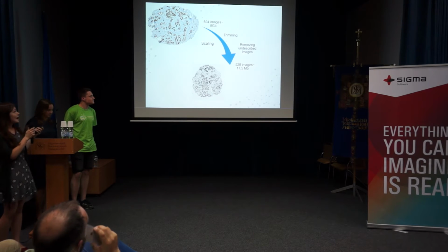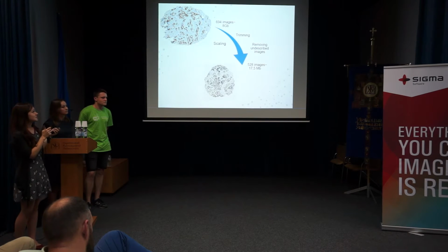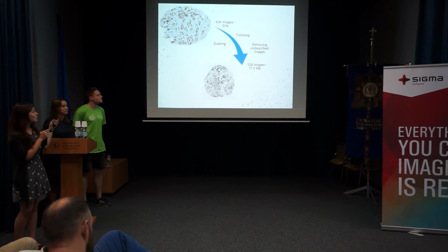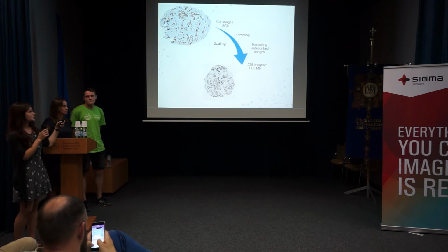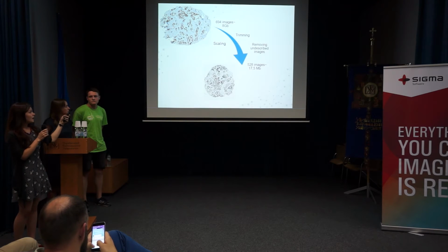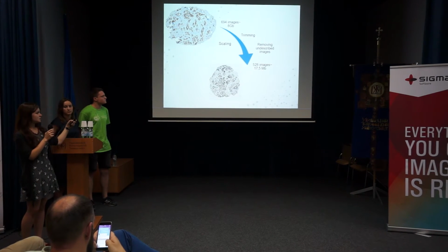About the input data, we had 694 images that weighed 8 gigabytes. It was actually quite a lot for us, and we had to clean all this data, like remove the white borders. By the way, we had a CSV file where the doctors wrote their predictions about how likely a certain person is to have cancer or not. And we had to remove the data which did not correspond one to the other in the file and in the data folder. Also we had to do the image scaling, like compress all our data and make it grayscale.